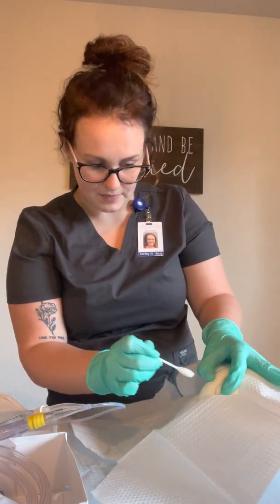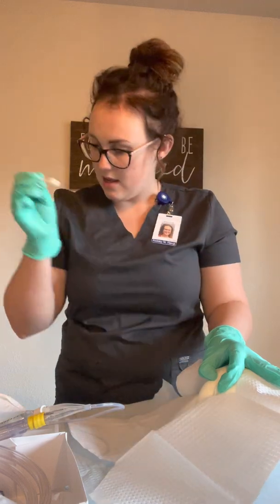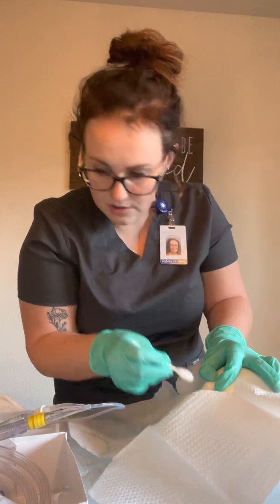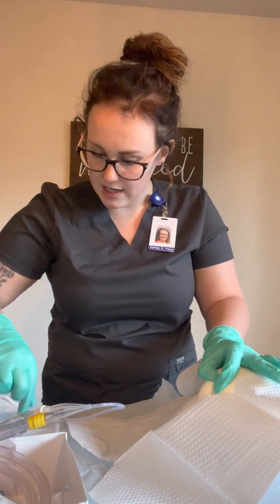I'm going to use the first swab to cleanse here furthest away from me on this side. Swipe once, and then I'm going to place in my container, making sure that I'm not crossing over my sterile field. I'm going to take my next swab, and I'm going to go closest to me. And then I'm also going to discard this without contaminating my sterile field. And then the third swab, I'm going directly down the middle, and I'm looking for the wink, where I'll see a little opening of the meatus that's going to help tell me where I'm going to be inserting the catheter. Okay, directly down the middle. And I'm still holding the labia open so that I can visualize as I do this.